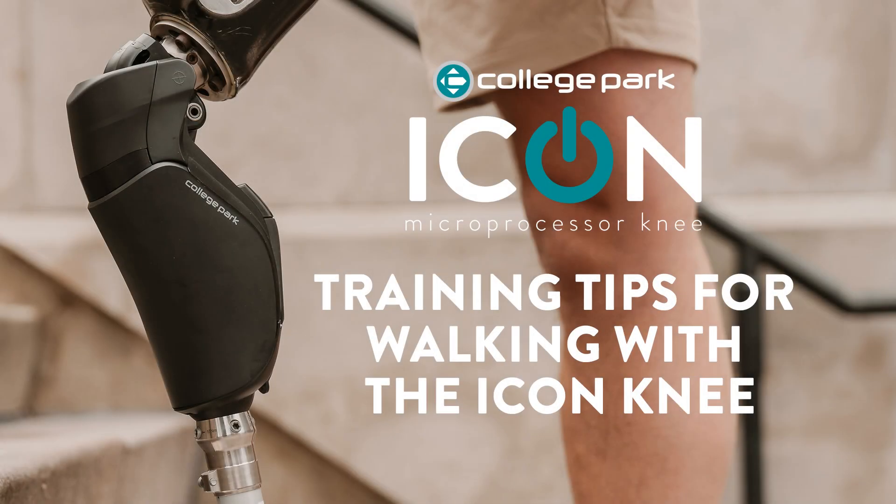Welcome to this training video for the ICON microprocessor knee. Our goal is to provide training tips for walking with the ICON knee that will make it easy for both you and your patient.